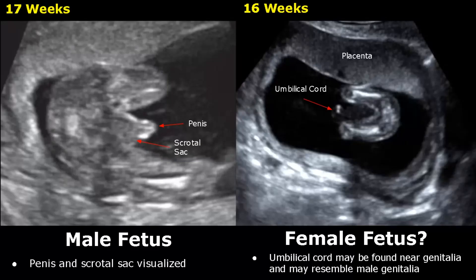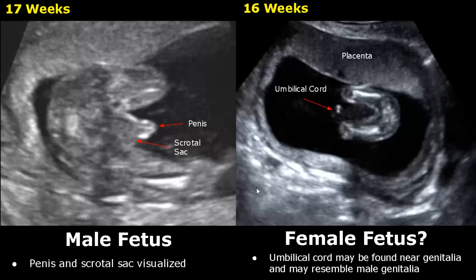Hello everyone, this is Dr. Sam and today we will study fetal gender determination on ultrasound. Fetal gender can usually be determined around 16 weeks of gestational age. In some cases, it can be difficult to determine the gender at this stage because of fetal position that makes it difficult to visualize the genitalia properly.